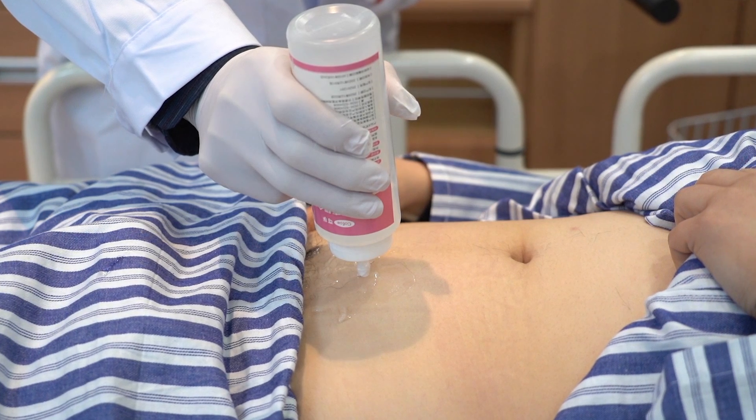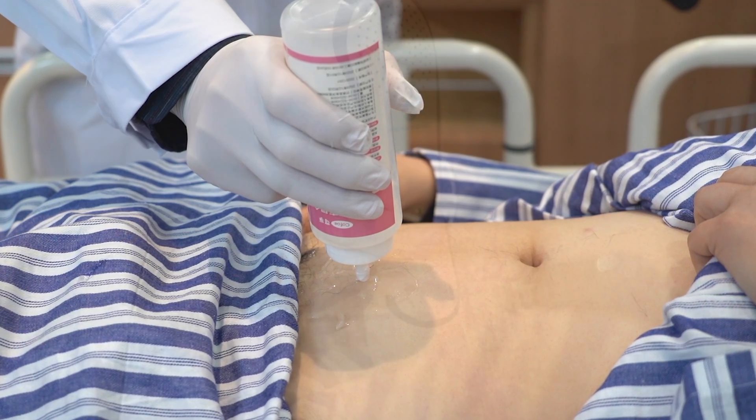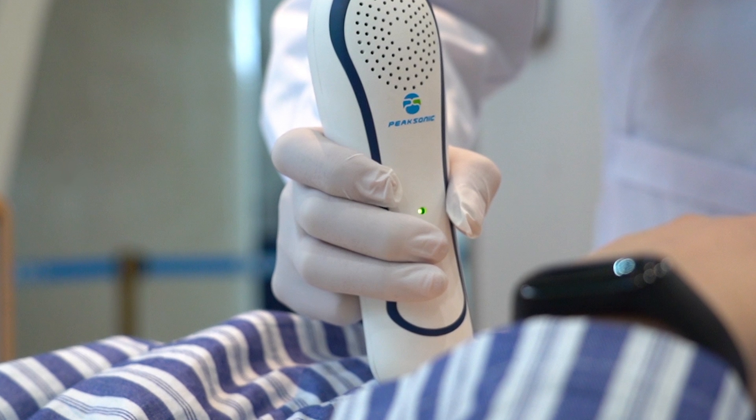Before inspection, apply the ultrasonic coupling agent to the skin three centimeters above the pubic bone of the patient. Place the instrument at the position shown in the figure and orientate the logo of the instrument towards the head of the patient.